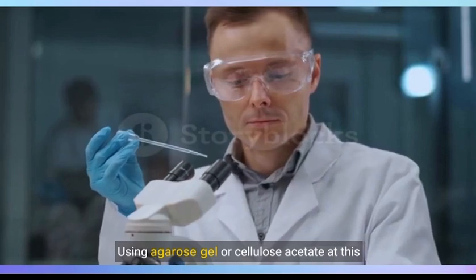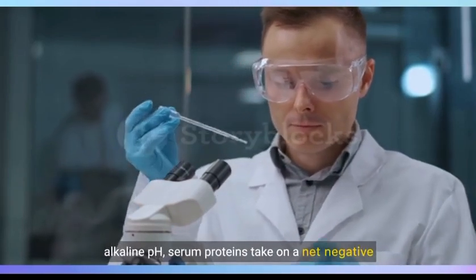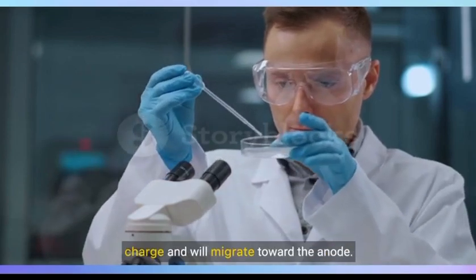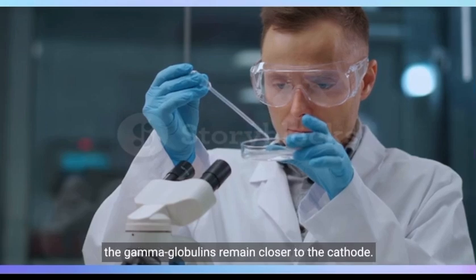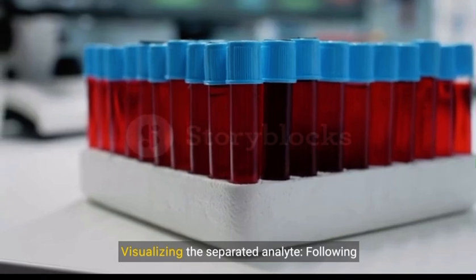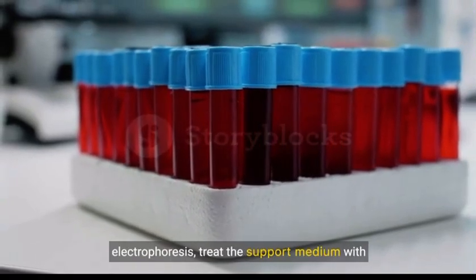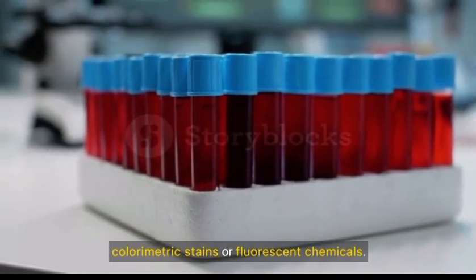Using agarose gel or cellulose acetate at this alkaline pH, serum proteins take on a net negative charge and will migrate toward the anode. Albumin migrates the fastest toward the anode, and the gamma globulins remain closer to the cathode. Visualizing the separated analyte. Following electrophoresis, treat the support medium with colorimetric stains or fluorescent chemicals.